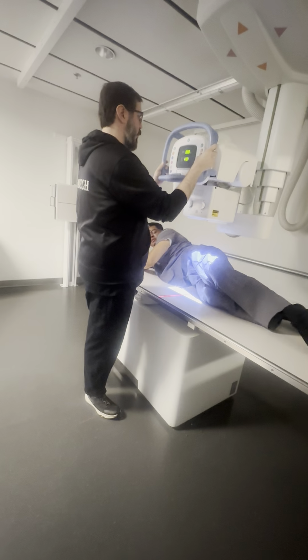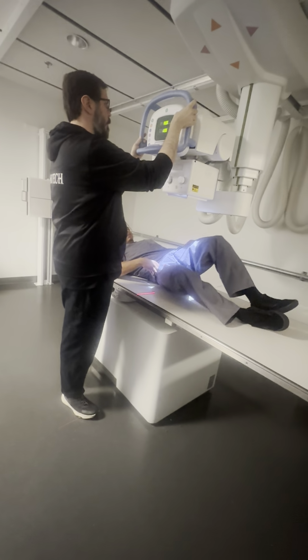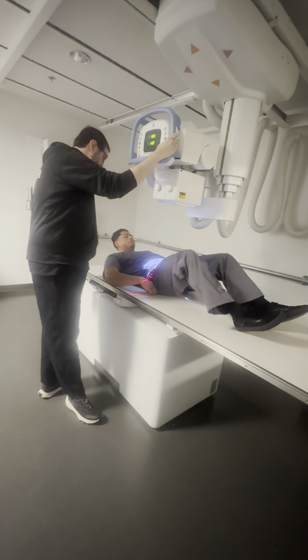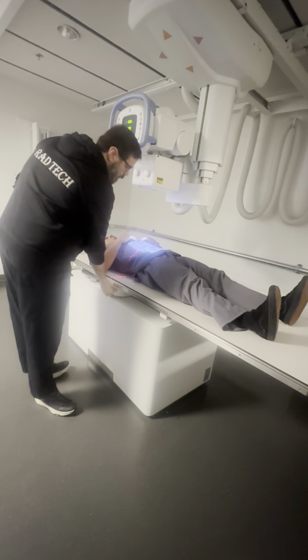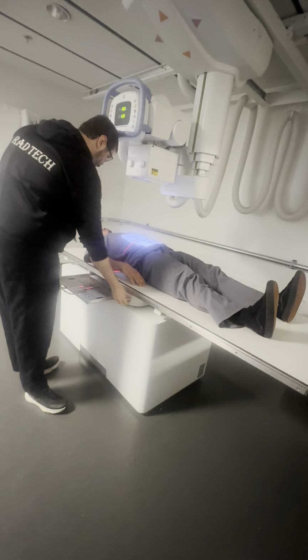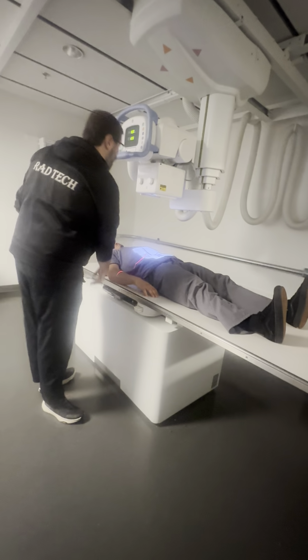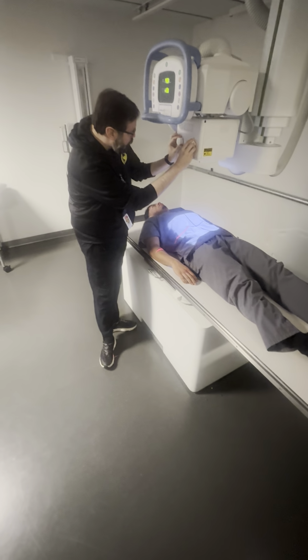Okay, so we're gonna move on to the small bowel. Now I can slide my bucky down because I'm gonna be working in here, right? For the small bowel, I want to use my full 35 and 43.